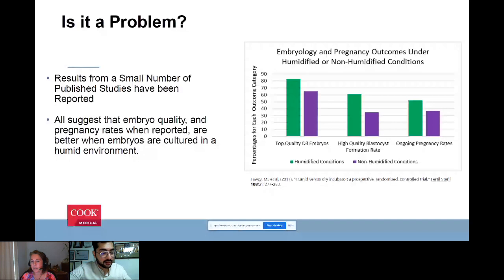I do think that the type of culture media has a high influence on the speed of cleavage. Some embryos from some patients seem to cleave quicker than others. That's another thing that I've noticed across labs. So you can't really do a generalization. I think you need to see in your system how quickly the embryos cleave, but you also have to look at the embryos of that patient because she might have embryos that cleave quicker generally. So I don't know if you really can do a generalization.